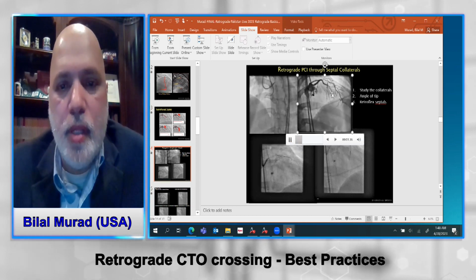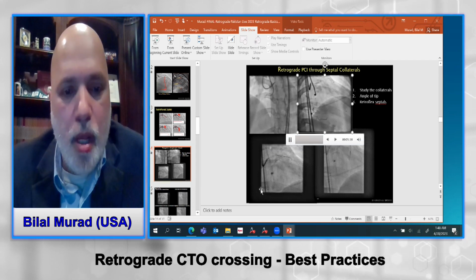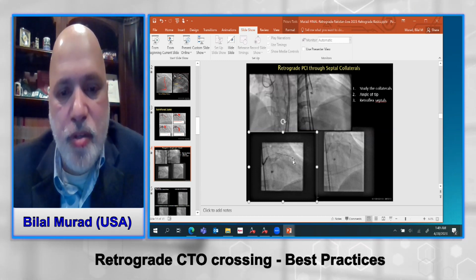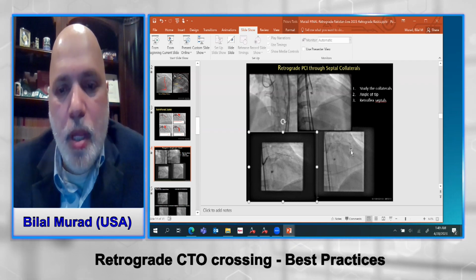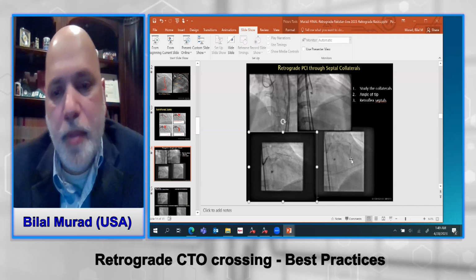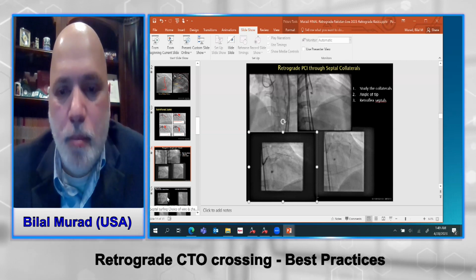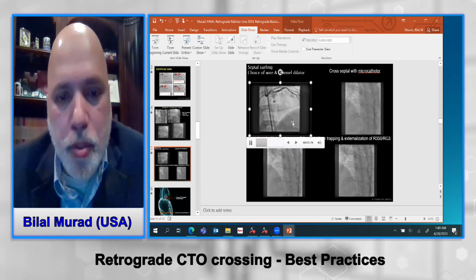You can see over here that the septal collateral is really a nice approach. However, the origin of the septal is a bit of a retroflex, which is why you see this little exaggerated angle over there. A Turnpike LP microcatheter was used to help enter the septal branch, after which this wire was taken out, and either a Sion wire or a SUOH 3 wire is used with a small 20, 30 degree angle, maybe at the most, to be able to enter and go through the septal branch.